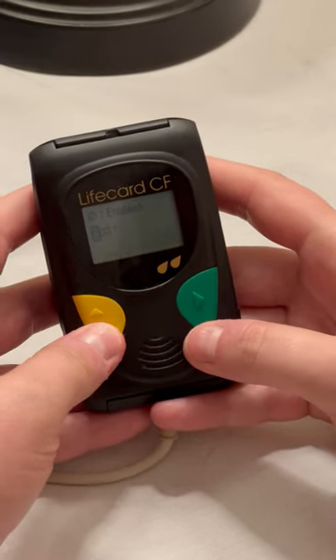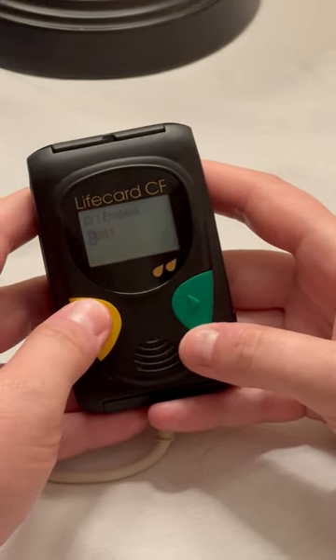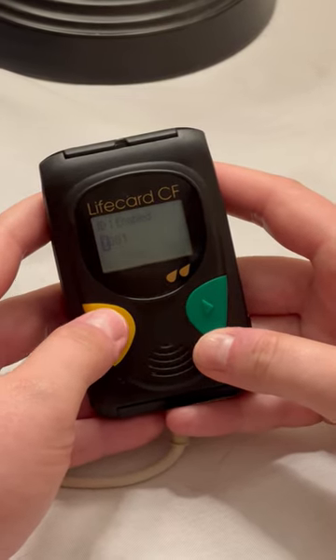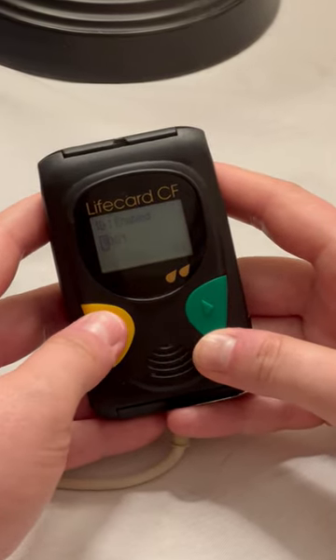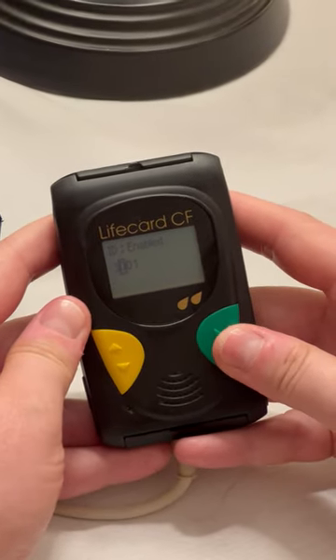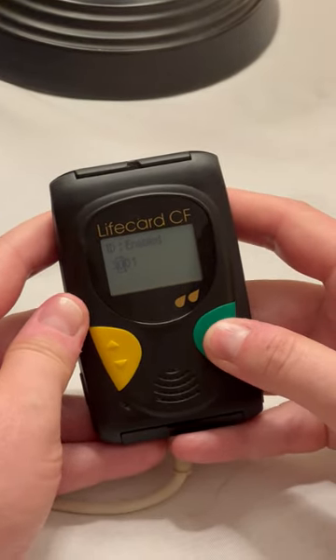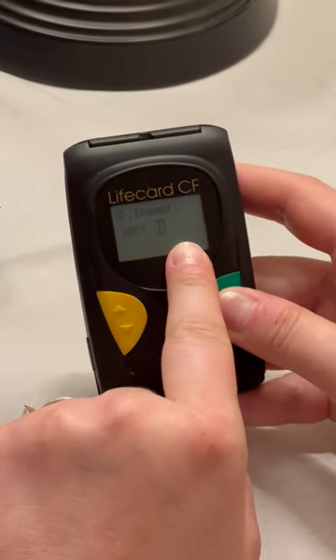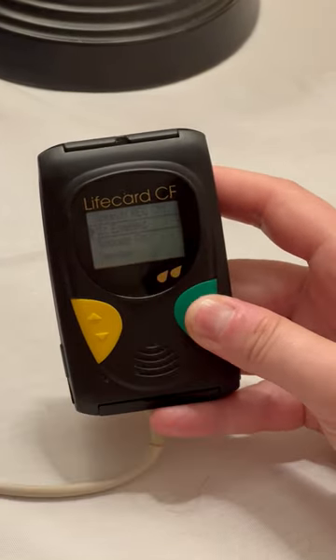We can change the number by scrolling. If you go from zero and push down, it will go through the alphabet in a backwards order. If you scroll up, it will start zero, one, two, three, etc. When you have the correct number, hit the green arrow to enter to the next section, continuing through each section. Keep hitting the green button until it goes back to normal.